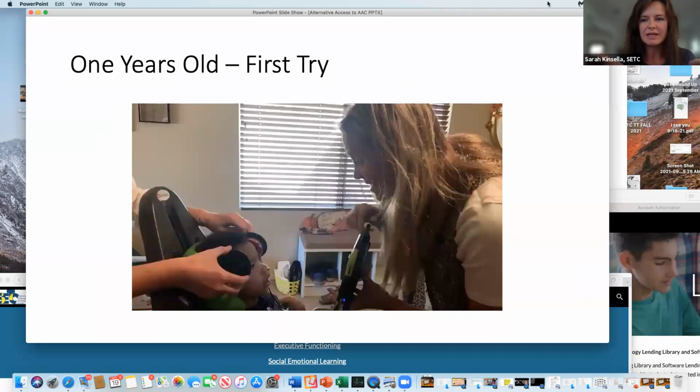I'll also often make a binder that has that with highlighted what you guys are working on right now. And then you can put little notes like, oh, this morning they used it to do XYZ, like listen to music. This was really motivating. So then when somebody comes in later, or you're not in the classroom later in the day, they can look at it and say, oh, okay, I'm going to go for that. Perfect. I love that idea.